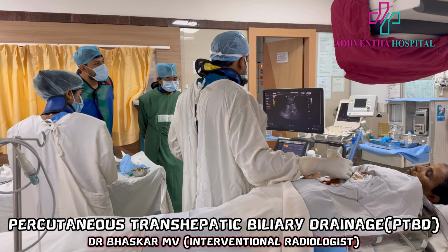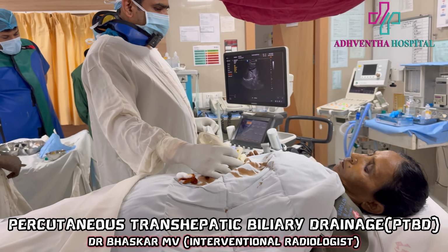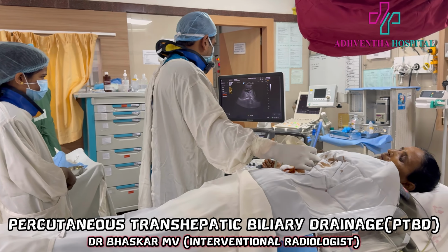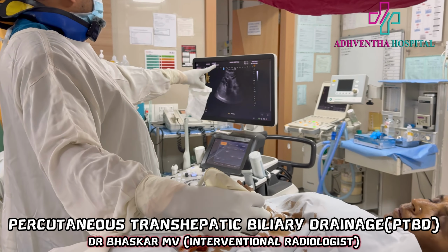This is a around 60-year-old female. So she has come with a history of jaundice. If you can see, she has jaundice, yellowish discoloration of the skin. And this is the liver. This is the ultrasound scan. When we see the ultrasound scan, this is the liver.